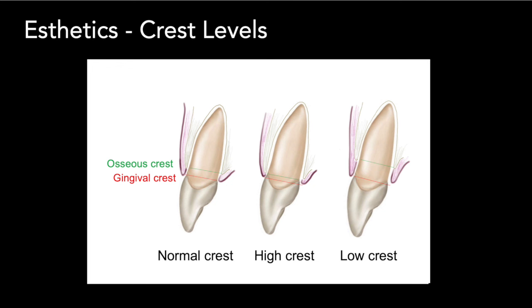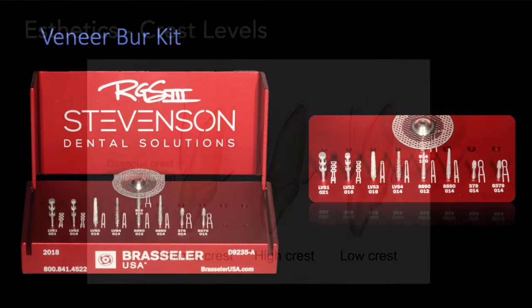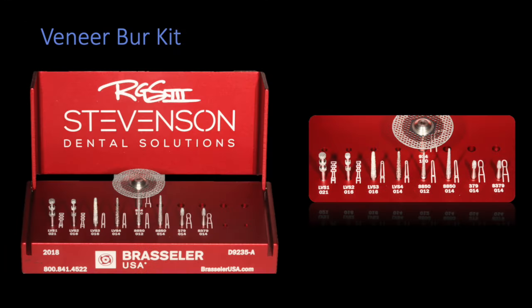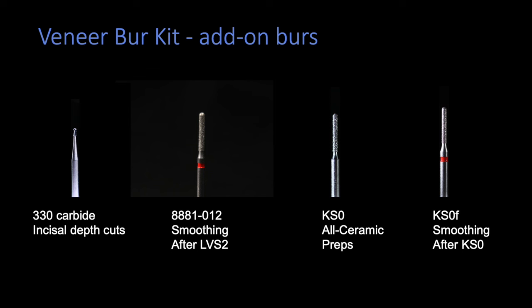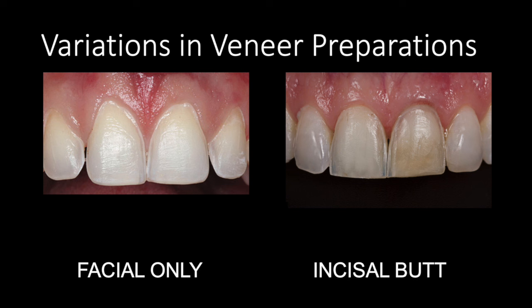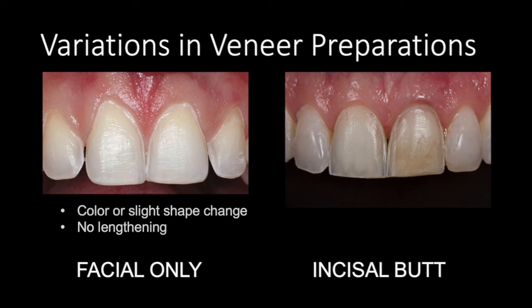In a low crest patient they're very susceptible to gingival recession, and these are the cases we need to be very mindful of. Let's get started with the preparation. You've already seen this bur kit in the first two sessions; we're going to use a few different burs today. We'll move into the incisal butt veneer and make the preparation a little bit deeper than we did in the facial-only prep. Remember that the facial-only preparation is really only for slight color changes or shape changes, and you can't do any lengthening to the tooth with that preparation.